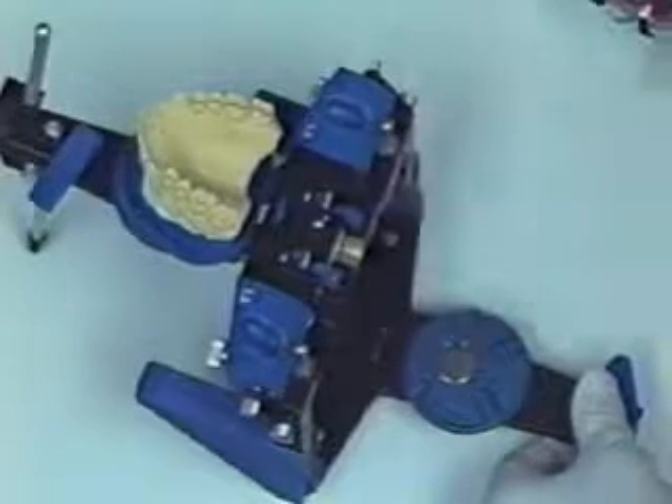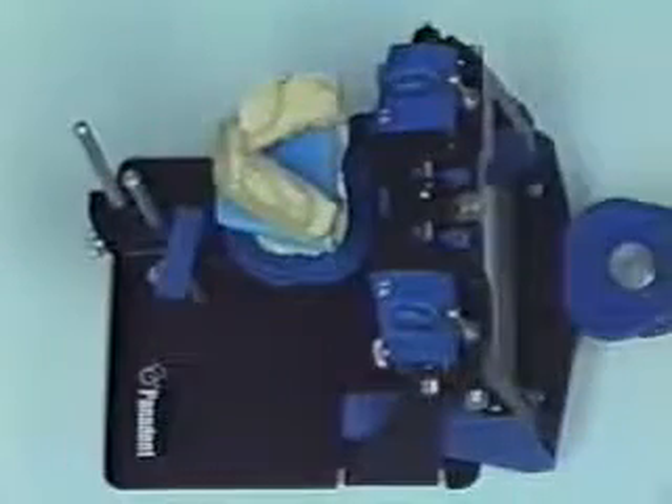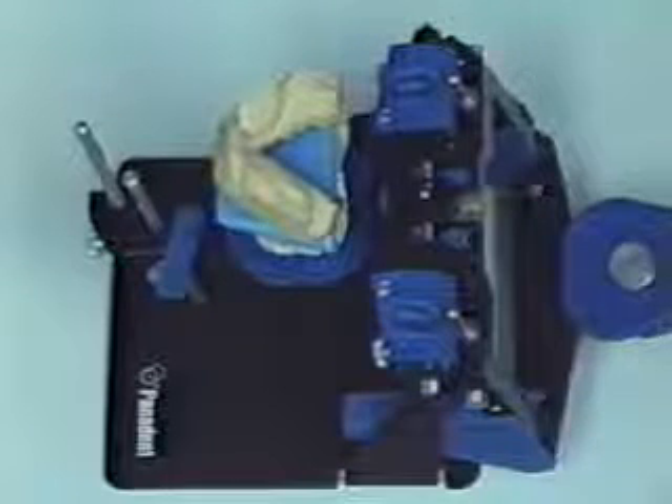Forceful opening at this point may create some breakage in the maxillary cast. Simply by releasing the centric latch, the articulator can now be lifted right out of the maxillary tray. The adjustable mounting platform can now be removed and replaced by the magnetic mounting plate.